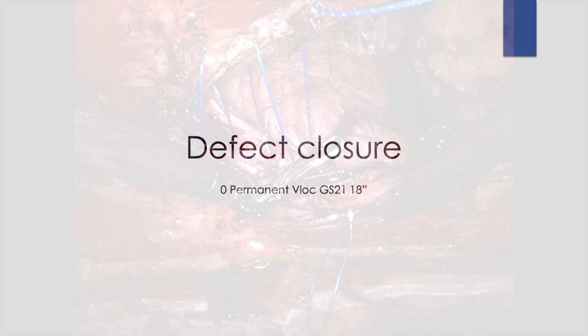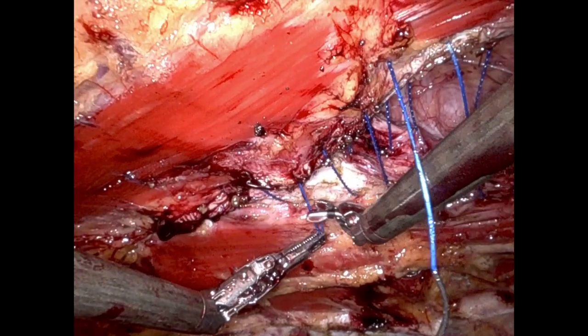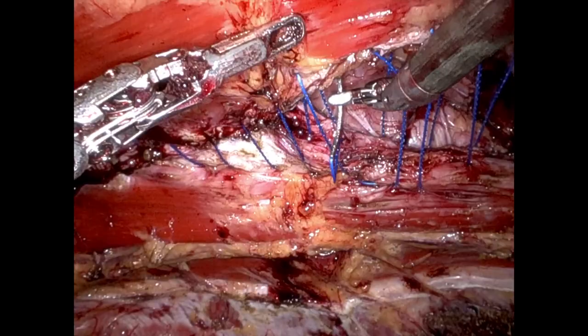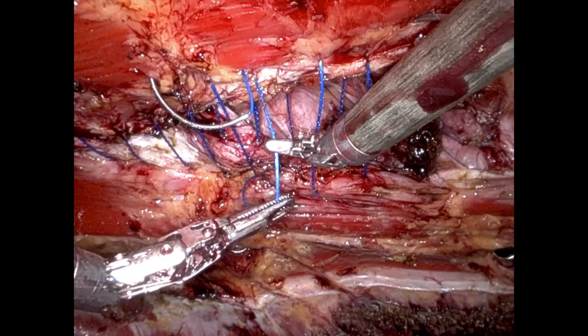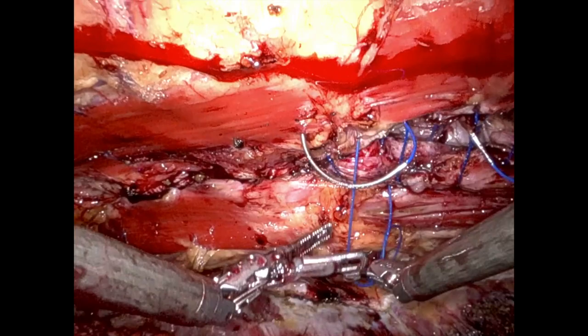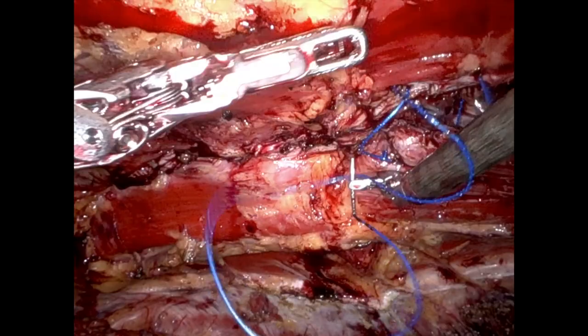After closure of the posterior sheath, we then move forward with defect closure. I will usually use a number 1 V-lock on a GS-21. We're carefully applying traction to the abdominal wall to allow the midline to close, and over a few runs you'll see the midline comes together nicely. Shortly, we'll start locking the V-lock suture as we sew back over the suture line.